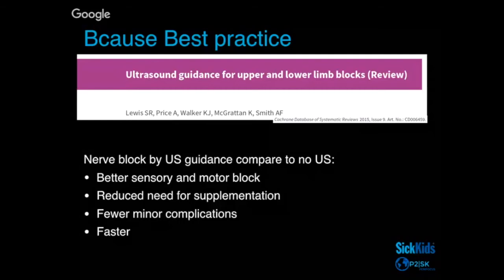But I mean, they do nerve blocks all the time, anesthesiologists, right? So they're kind of used to doing it. It's not the same for us in the emergency. We don't do that as much. So if there is something that can help us be safer, and for us, definitely workflow is important as well, so if we are faster doing that with the ultrasound, let's use it.